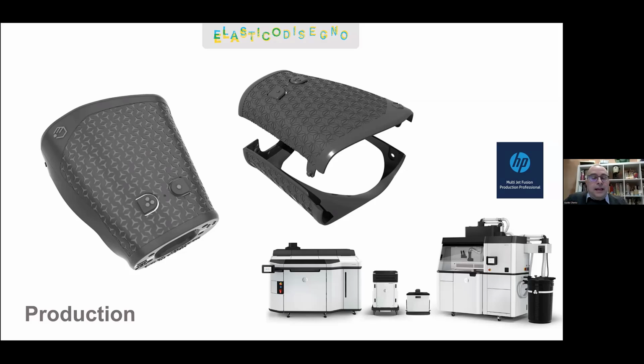This has also allowed Prensilia to periodically receive user feedback from the amputees using this device, and rapidly implement the changes, make adjustments with no impact on tooling, because there's no tooling. The only downside at the time, this was 2019, was that the color options for the 3D printed parts with Jet Fusion printers were quite limited, because the parts come out of the printer in a kind of dark gray color. It can be tinted by immersion, and so you can have all variations of gray, dark gray, or black. So not that many options.